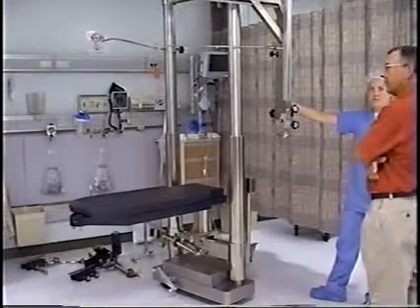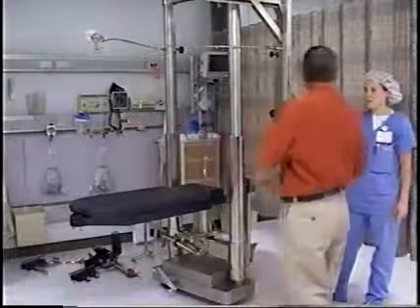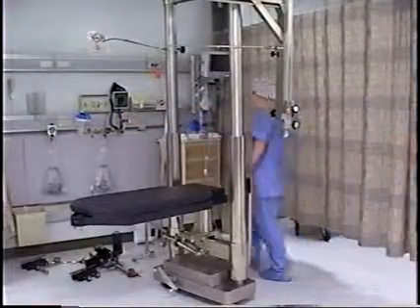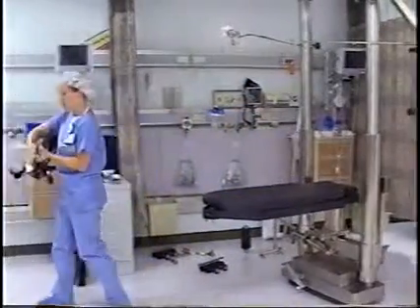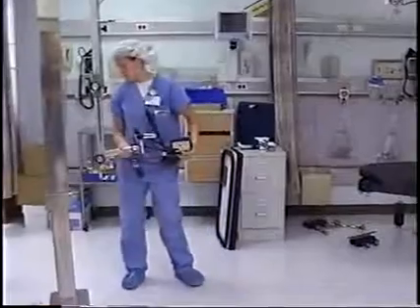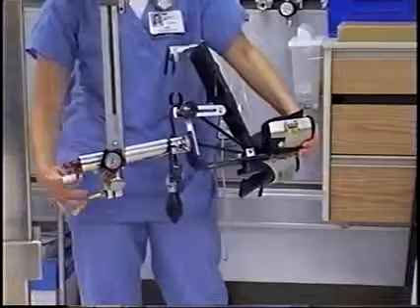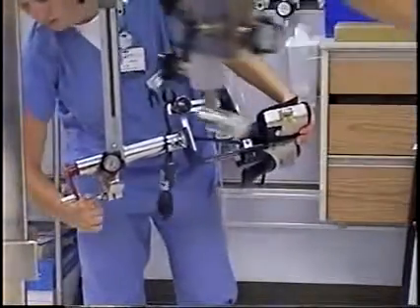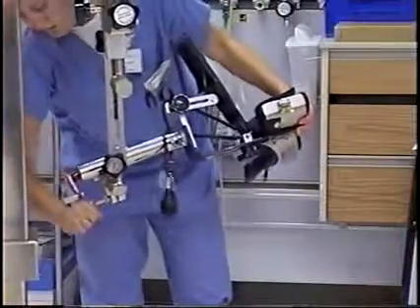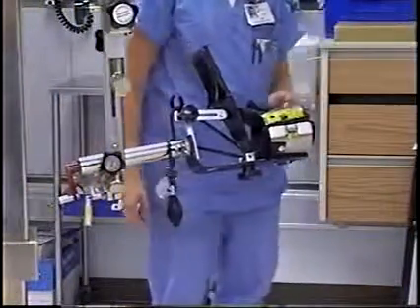So if you're doing a right, you're going to pull traction from down there. Can you just leave this there? You can just leave that there. But if the anesthesia doesn't like that, then you would move it. Oh, yeah, all the way out. Is there IV poles going to be there? Sure. Let's just assume anesthesia says move that out of the way so we can move it down here and get it out of the way. But guess who's going to win?